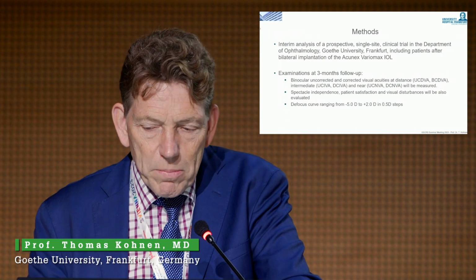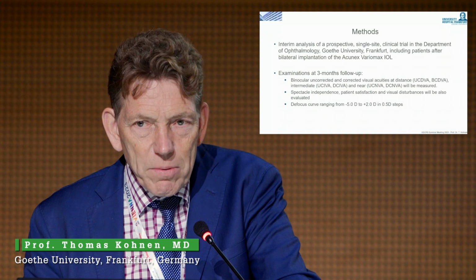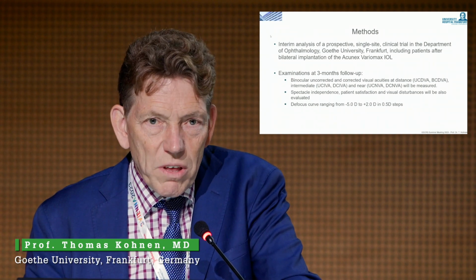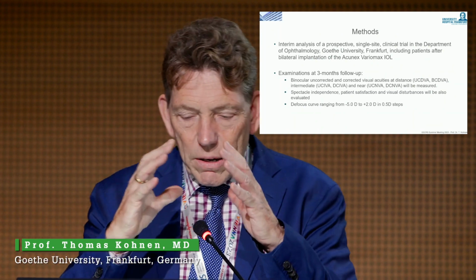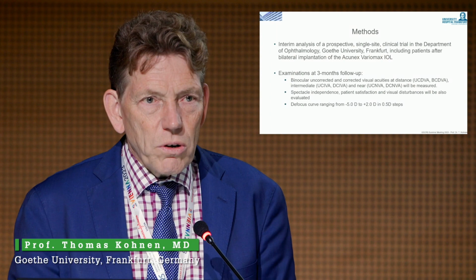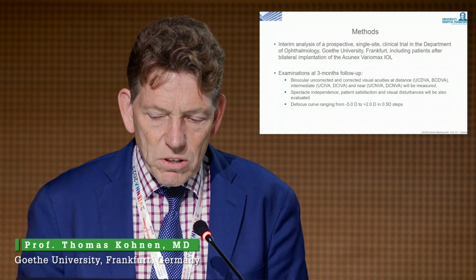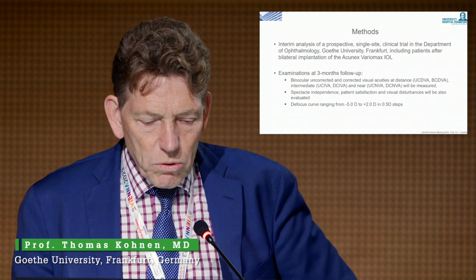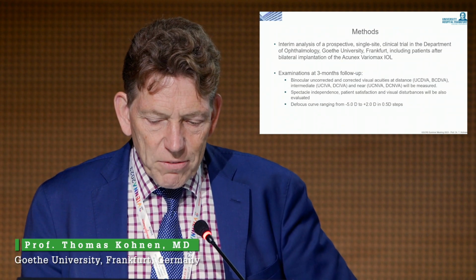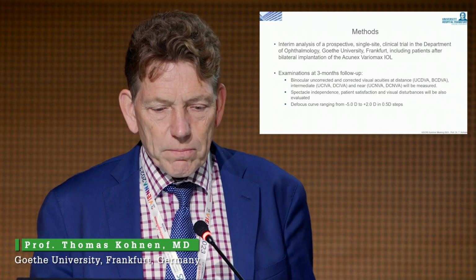When you write up these papers, you always have to use these long words. So the abbreviations help. If you're interested in how to do that, that's published in the Journal of Cataract Refractive Surgery 2010. I put a little table together where these are summarized. In every journal, you find them in the beginning. Spectacle independence, patient satisfaction, and visual disturbances were also evaluated. The focus range from -5 to +2 in half a diopter steps was also done.